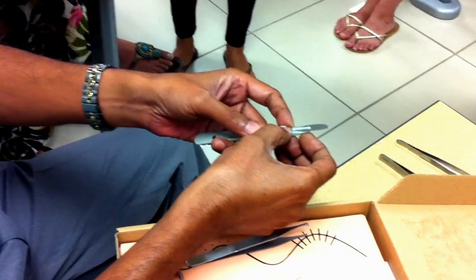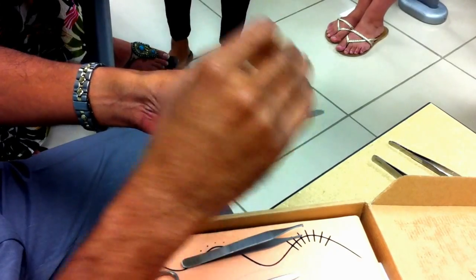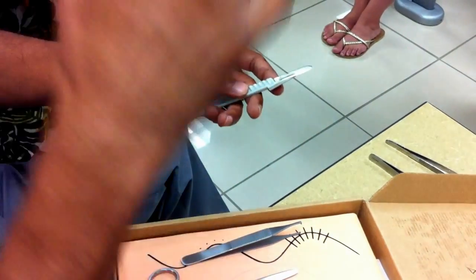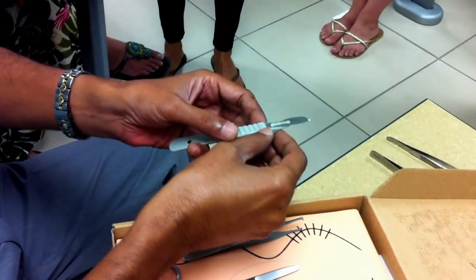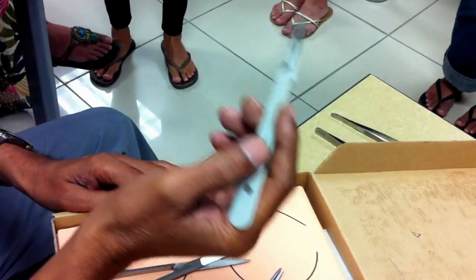Here, this is size 10. It ranges in size. There are different grades for it: 10, 11, 12, 15, 21, 22, 23. 22 and 23 are very big ones, which we use for cutting the abdomen and things like that. And usually for small suturing and for small incisions, we use 10.